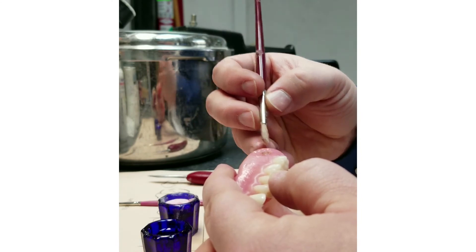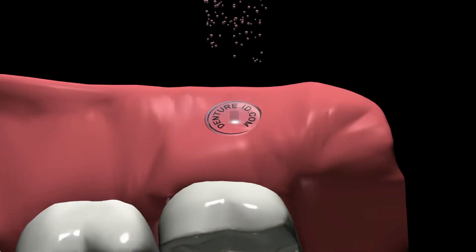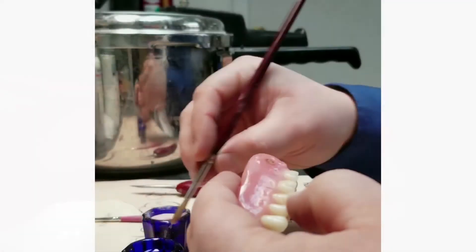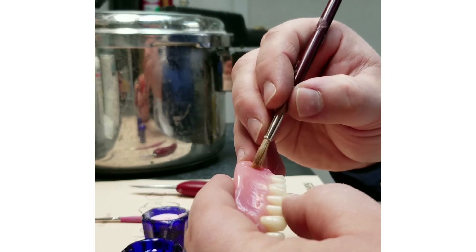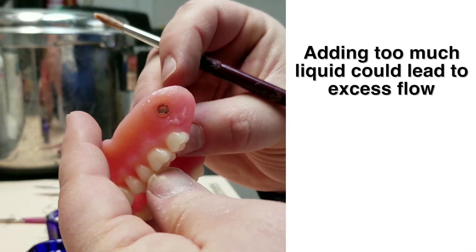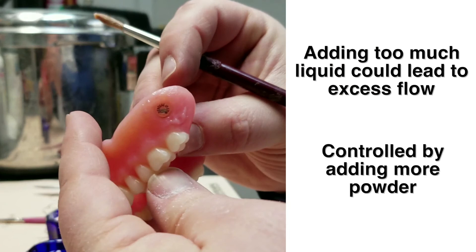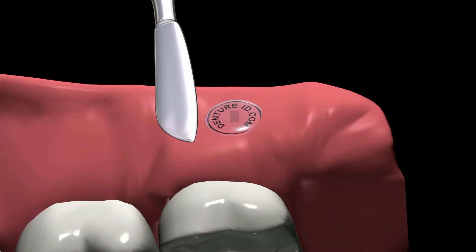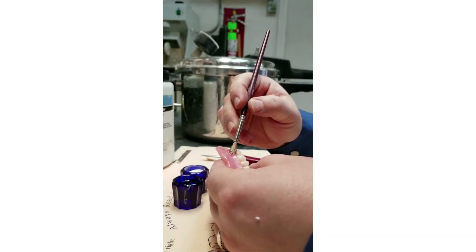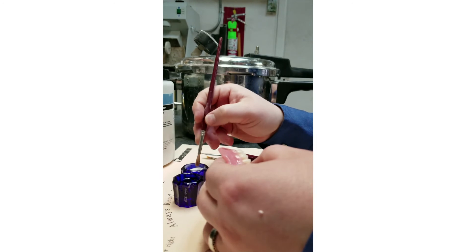First, wet the surface of the denture with liquid. Then sprinkle powder on in a thin layer. Saturate powder by slowly adding liquid with a dropper. Continue adding powder and liquid alternately until the desired thickness is achieved. Too much liquid added at one time may result in excessive flow, which can be controlled by the addition of more powder. Trim excess material while still in the rubbery dough stage using a sharp instrument. Smooth the surface of the appliance using liquid and a brush.